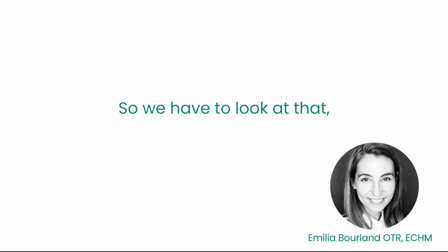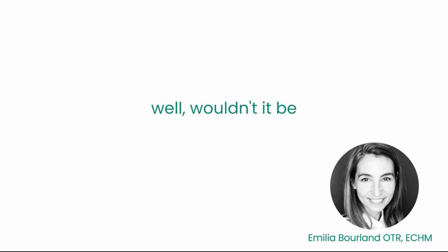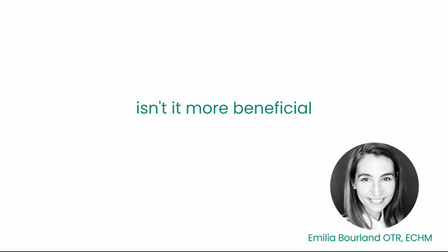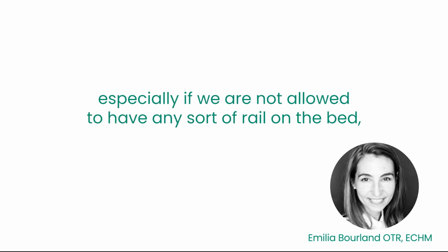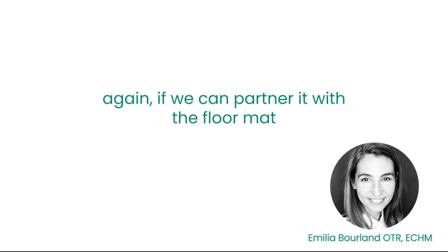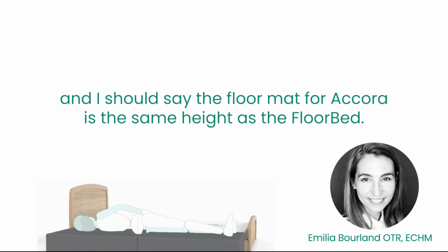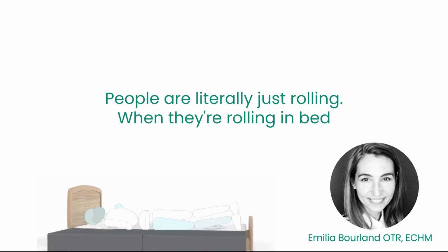So we have to look at that kind of cost-benefit analysis. For people for whom it is appropriate, isn't it more beneficial to them to not risk having that fall if they are rolling out of bed, especially if we are not allowed to have any sort of rail on the bed? And if we can partner it with the floor mat, and I should say the floor mat for Accora is the same height as the floor bed, so there's no drop at all. People are literally just rolling.